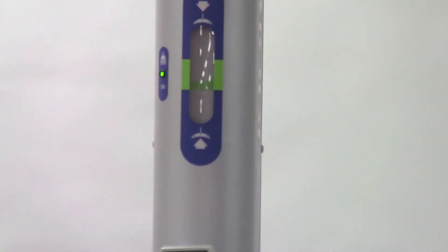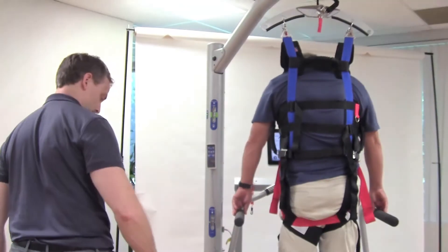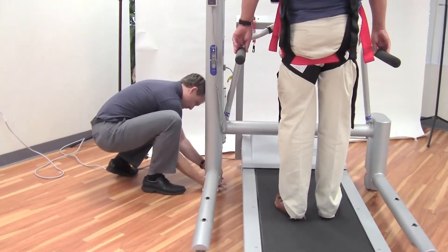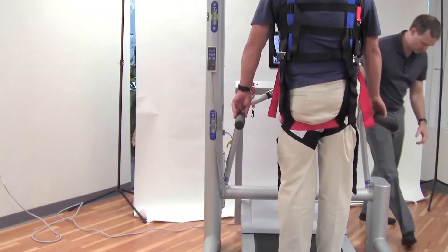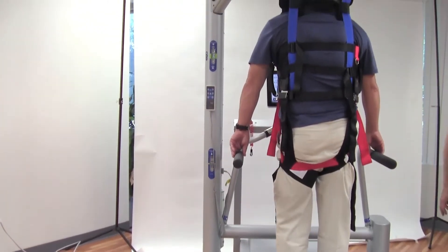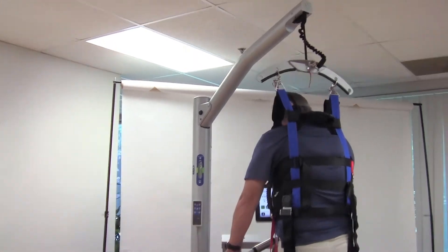Now we'll lock our casters and then proceed with gait training.